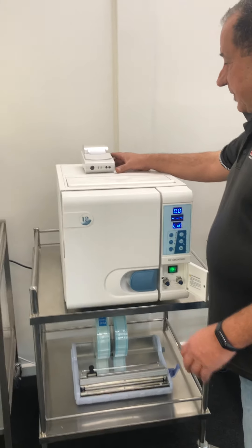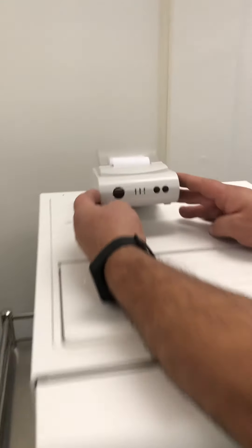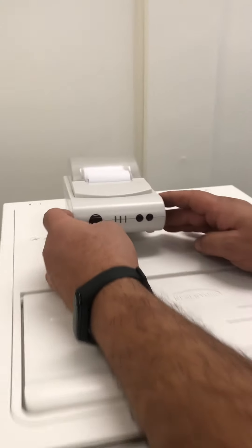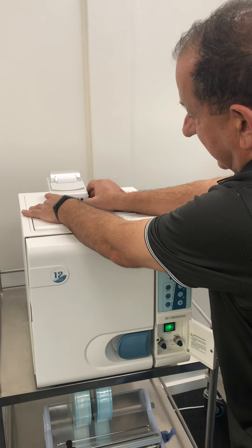Once you've set it up and you've got your printer, make sure there are two green lights on your printer. Press the right-hand button — the brown button — to make sure the paper's feeding okay.